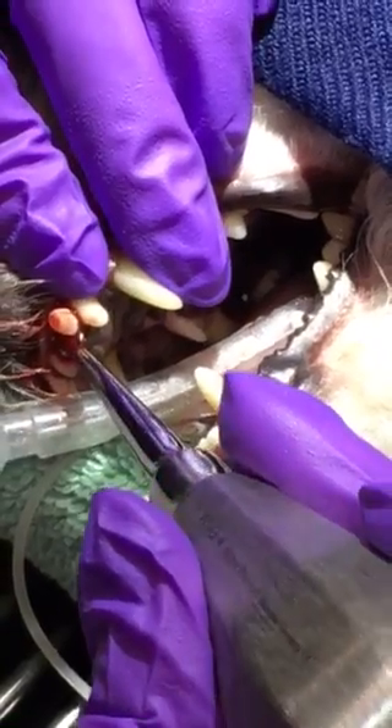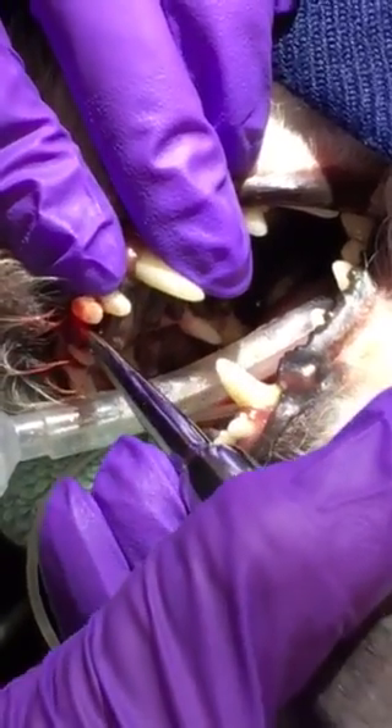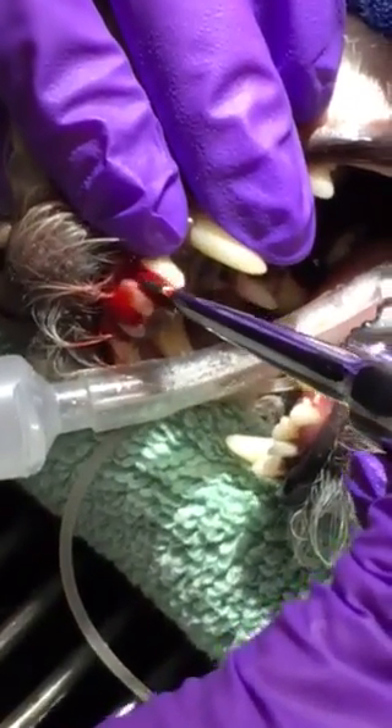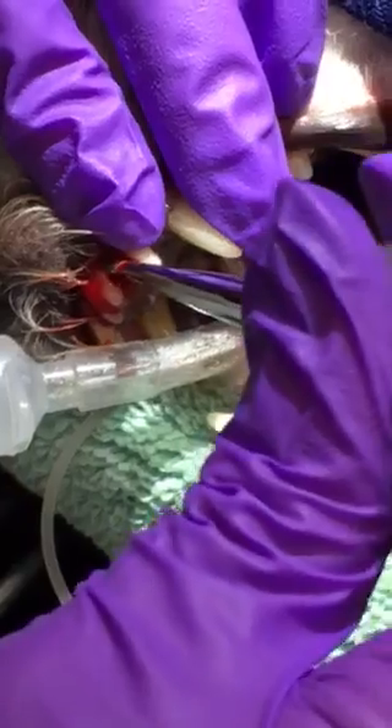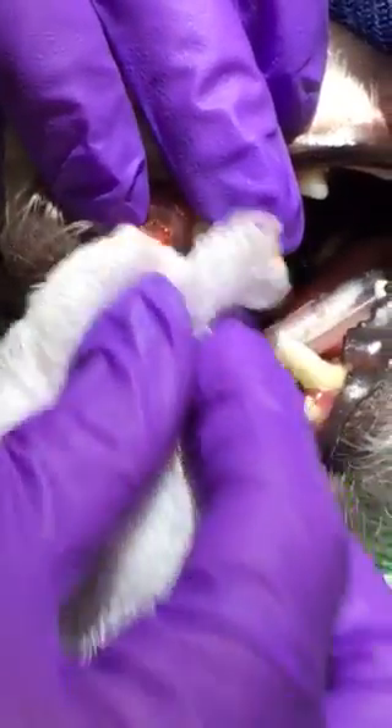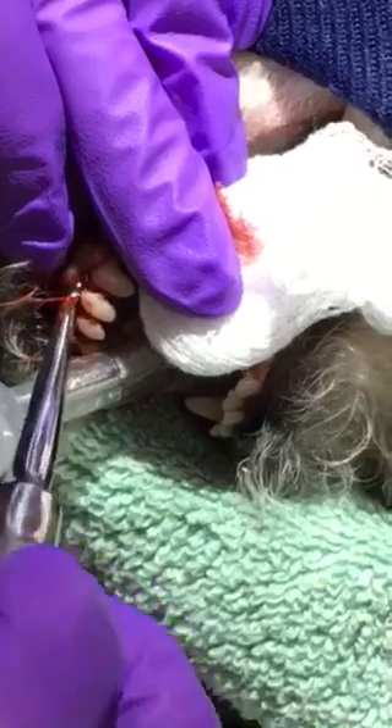The gums do bleed a significant amount — this is a normal amount of blood, as bad as it looks. We don't worry about it; we're going to stop the bleeding after the extraction. Once we get the gum tissue nice and loose from the tooth, we just keep the gauze there and go all the way around to make sure everything is nice and loose.